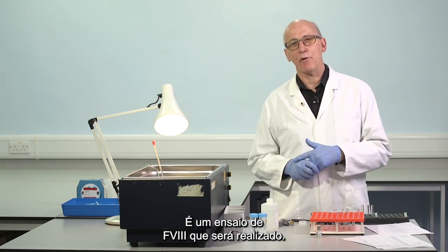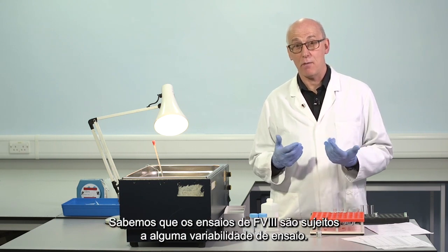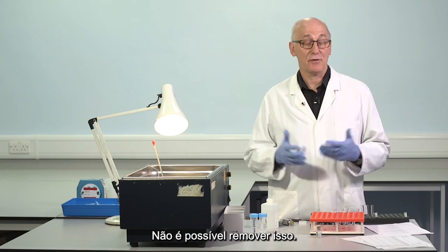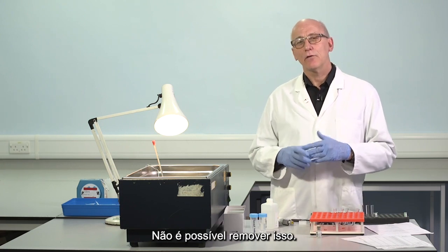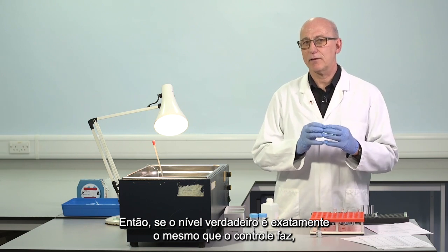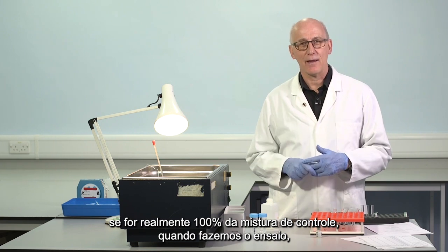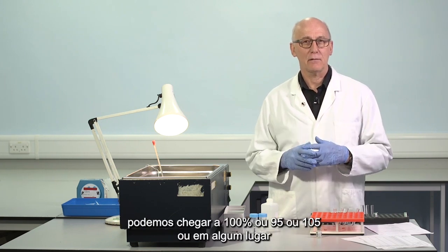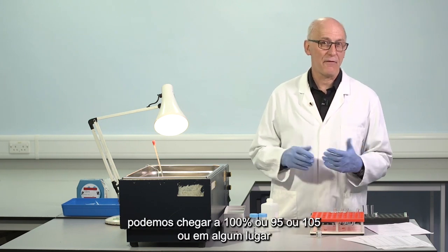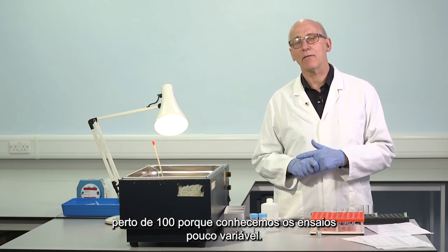This is a factor 8 assay we'll be performing. We know that factor 8 assays are subject to some assay variability. It's not possible to remove that. So if the true level is exactly the same as the control mix, if it truly is 100% of the control mix, when we make the assay, we might get 100% or 95 or 105 or somewhere close to 100, because we know the assay is a little variable.